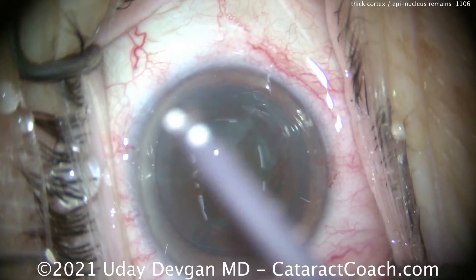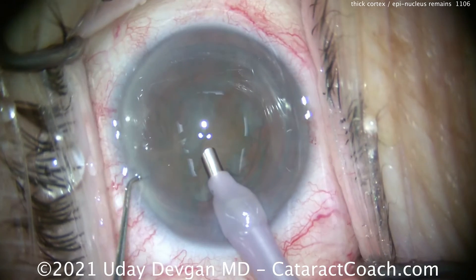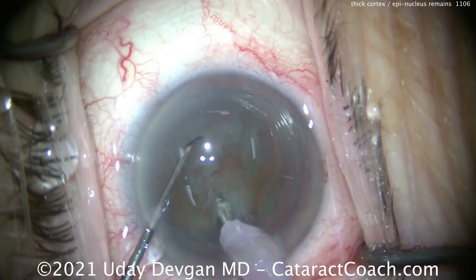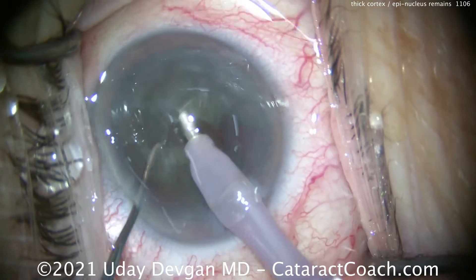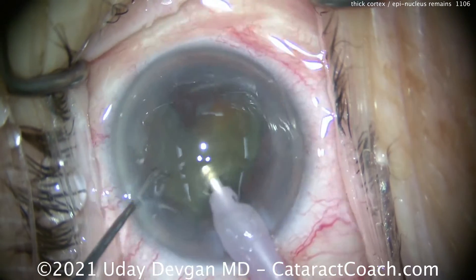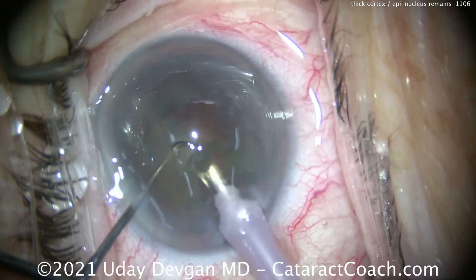The correct move here would be to go back and do more hydrodissection. Now the nucleus, or this endonucleus, can be easily removed. We'll get that chopper in there, tending up the iris to fix that reverse pupillary block. Chop this cataract in half — that's an easy chop. Two halves done, and we'll take each half out of the bag. But you can see each half that we're removing is a little bit smaller, because we're removing the endonucleus.